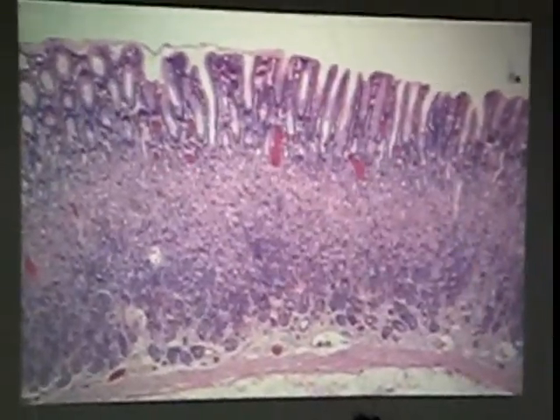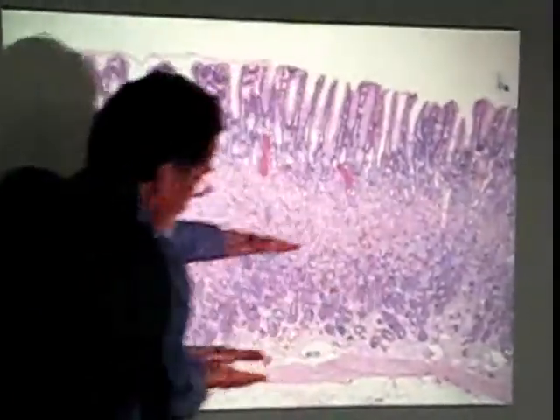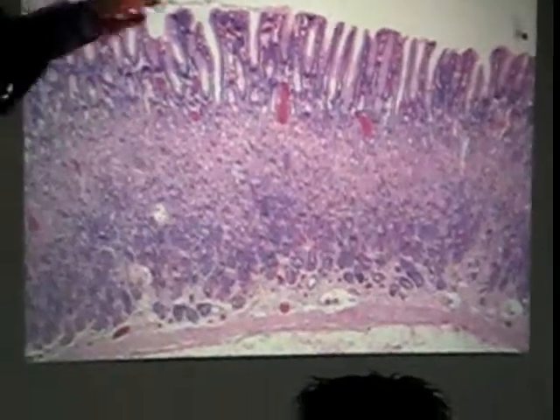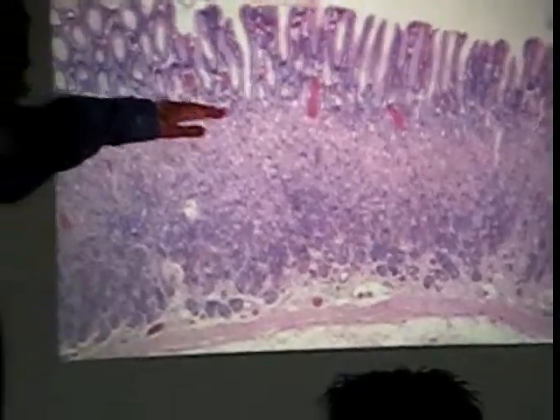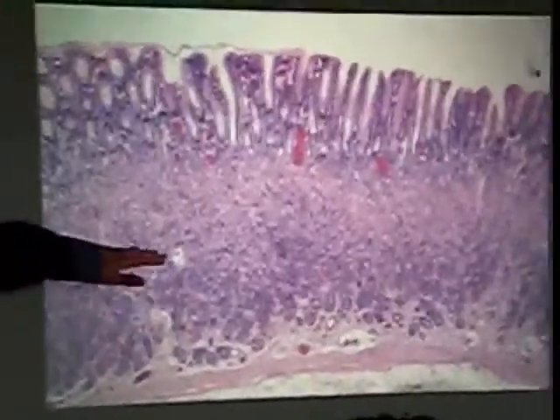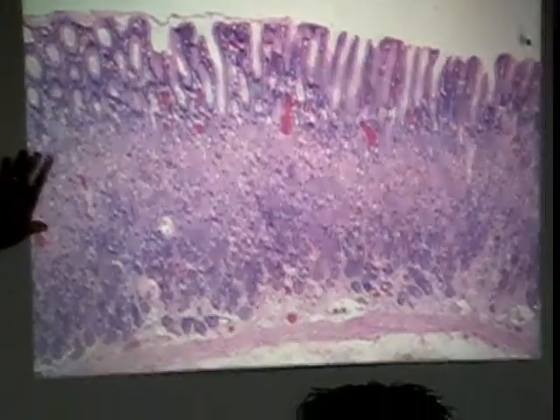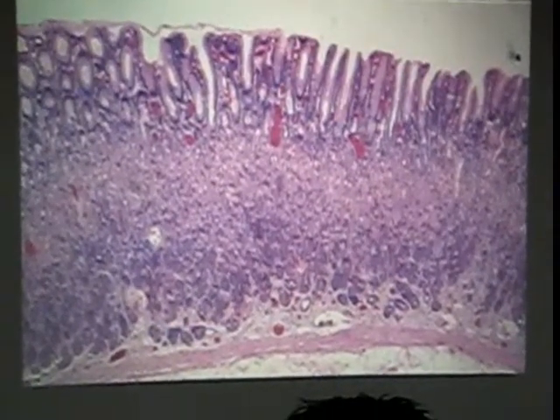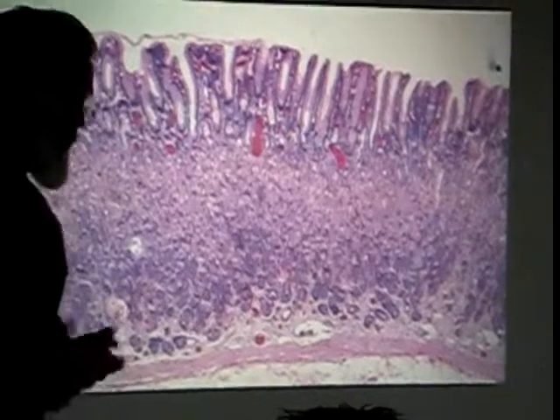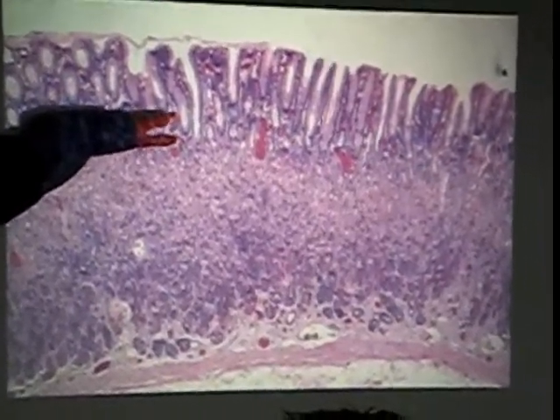If you look at this, you can see that there's tri-layers or tri-colors, right? You've got this region here, you've got this region right here, and this region here. This is the gastric pit region, or the region where you have the ducts from these gastric glands emptied. Where you have a lighter staining, the way I see color, a slightly pinker region, is a region where what cells predominate? What are they producing? HCl. Which explains why you need all these surface mucus cells cranking out mucus over time, right?